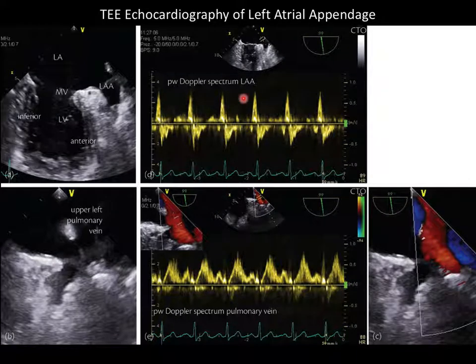Okay, again, this is looking at Doppler signal, which is used very often in echocardiography. In fact, you usually take Doppler data on every case, every patient. And what's being done here is we're looking at flow. This is velocity, remember? This is velocity towards the transducer, velocity away from the transducer, and this is 0.